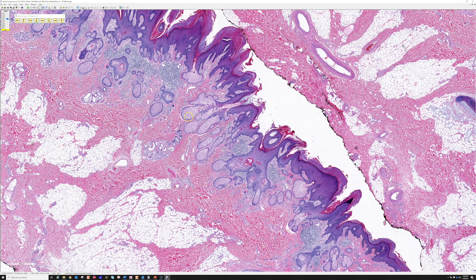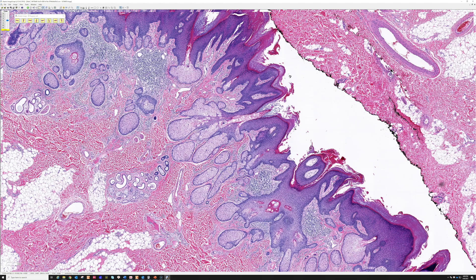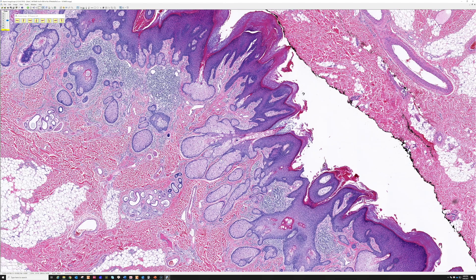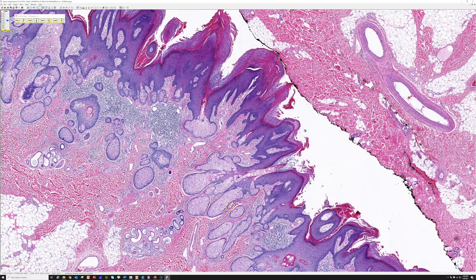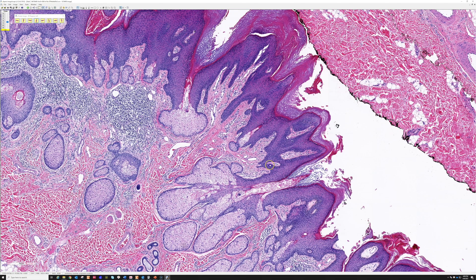Point number two is we have large sebaceous glands. Normally sebaceous glands drain into an adjacent hair follicle, but not these. Most of them drain directly through their duct out to the skin surface — so that's abnormal.